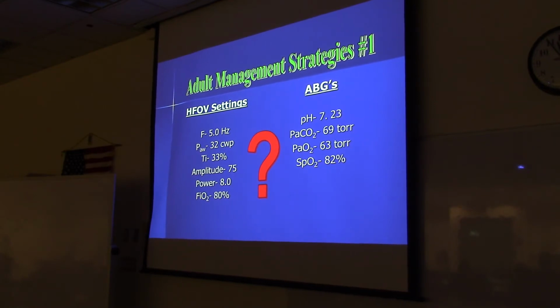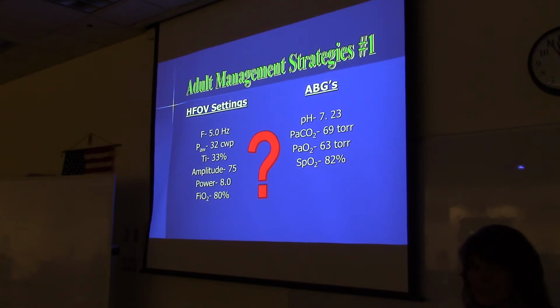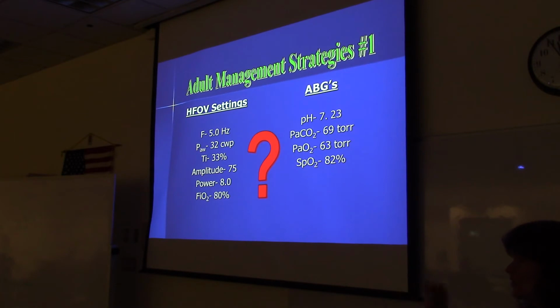Should we change the hertz? We know that if we turn the hertz down, we're going to get a bigger tidal volume. That decreases CO2, so that could possibly work. Typically, though, we don't, right? Oh, right. The hertz stays according to the body size, even though we know if we turn it down, lower hertz, bigger tidal volume.